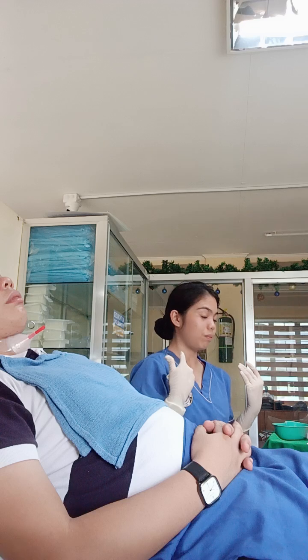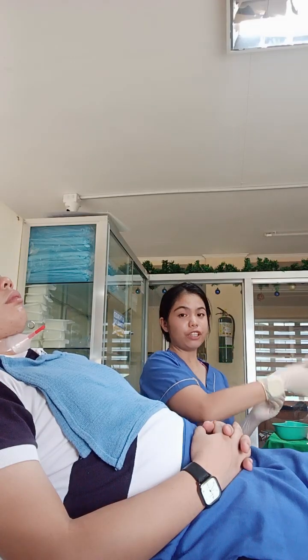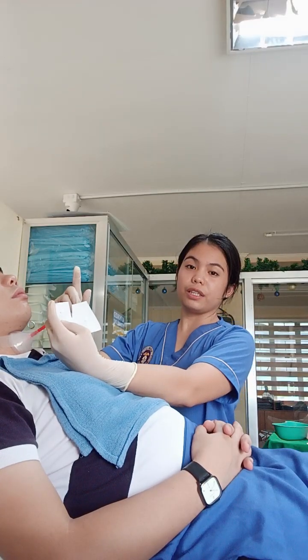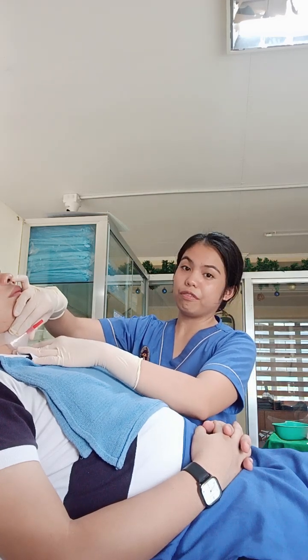Once we have carefully and gently replaced the tie, we can now move on with changing the tracheostomy dressing. There is already a commercially prepared tracheostomy dressing in our tracheostomy cleaning kit from earlier, so we utilize that. And then we put it toward the client with our other hand carefully securing the cannula in the exterior flange.